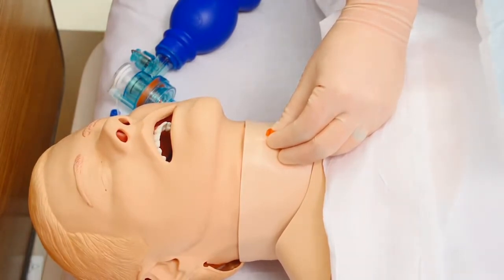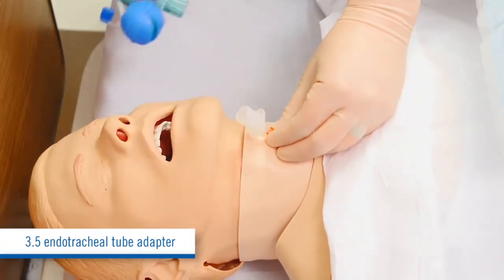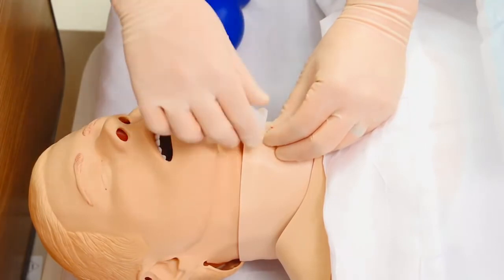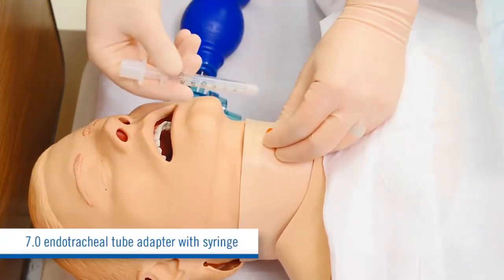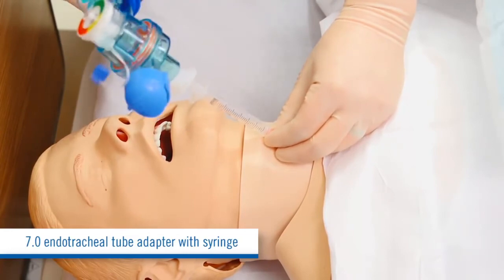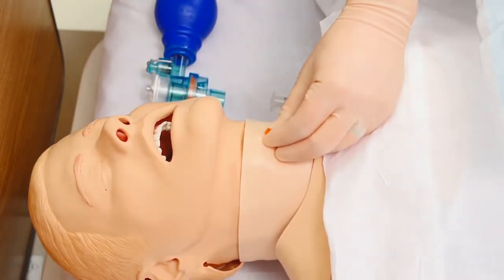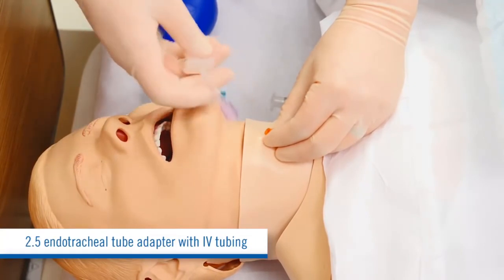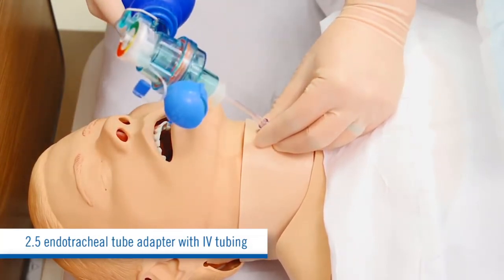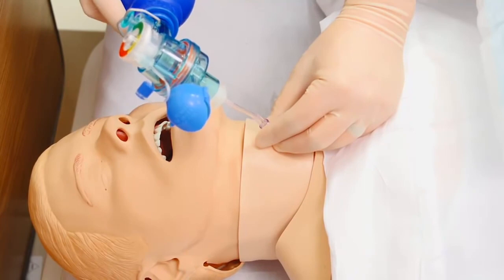Then attach one of your three setups: number one, a 3.5 endotracheal tube adapter; number two, a 7.0 endotracheal tube adapter with syringe; number three, a 2.5 endotracheal tube adapter with IV tubing. This is the standard method for performing a needle cricothyroidotomy and bagging without commercially available jet ventilation kits.